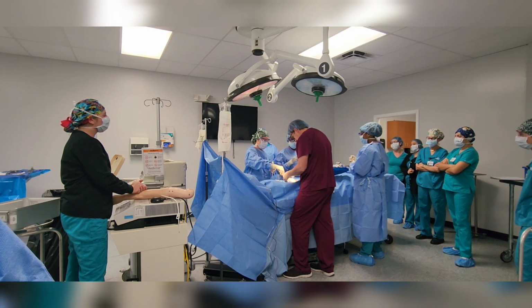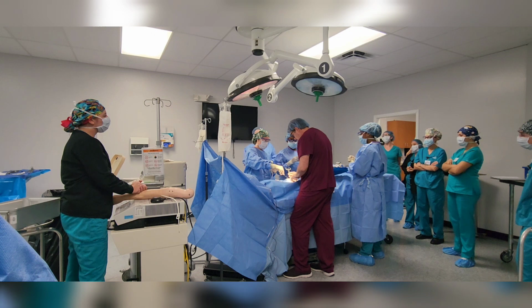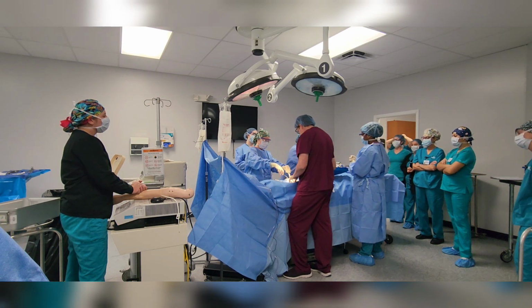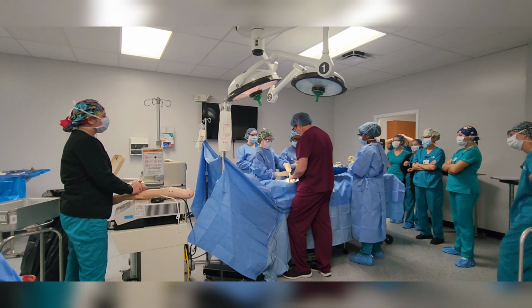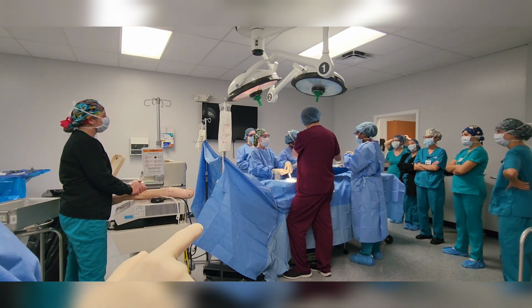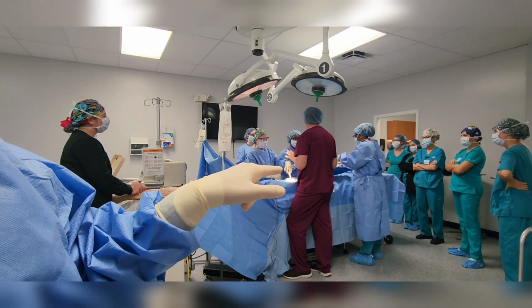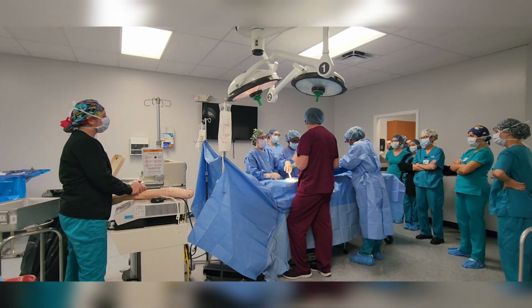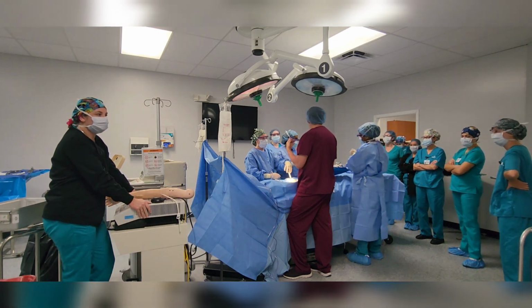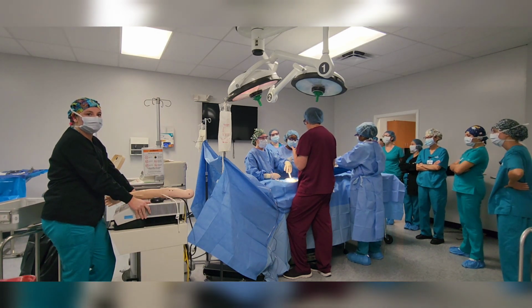Hold that up just like that. So if a doctor says, hold that there, don't move. Hold that up. And we would love taking it off there. Give me a Babcock. Take that off if you can. Perfect. Okay. So again, all these up there should have been like one clamp, right? And then you're good to go. So if something comes back, when you get it back real quick, just clamp it, put it right back up. So you don't have to think about it anymore. But that should be a kind of a thing.